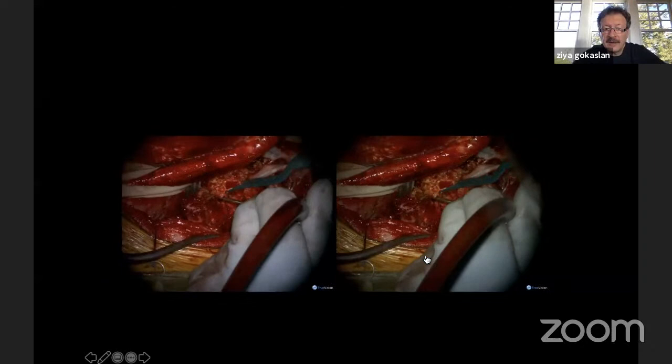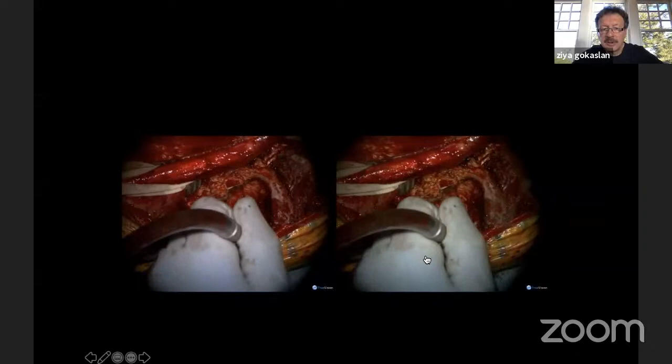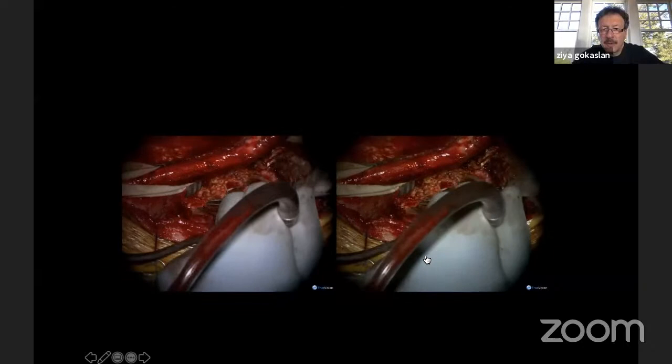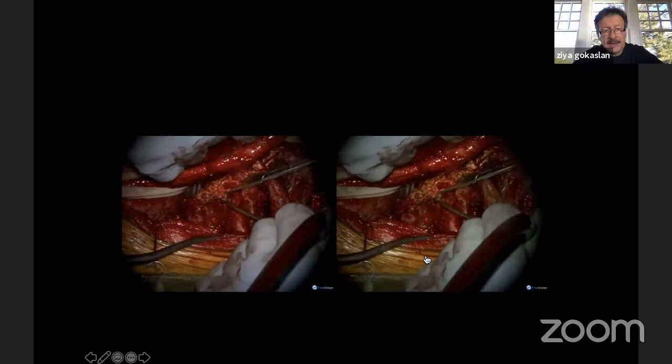And typically use blunt dissection for that. A couple of tethers you need to release. We typically do that under direct vision using bipolar cautery. One that goes into the foramen across the nerve root, but the nerve root can also be cut from outside, and then separately you can cut it from inside, and then get into that plane and gradually develop that plane under direct vision.